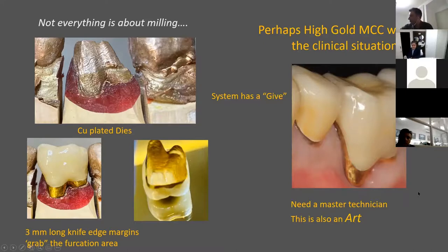So understand why I have gone back, for many years now, to using metal ceramic. I'll reduce the coping and possibly the tip as well. I prefer E.max on anterior restorations if it's equigingival or supragingival. If it's anything subgingival, it's always metal ceramic. The question colleagues need to understand: you have a 1.5 to 2 mm margin subgingivally and you bring in zirconia, how do you remove the cement? If you can answer that question, please go ahead.